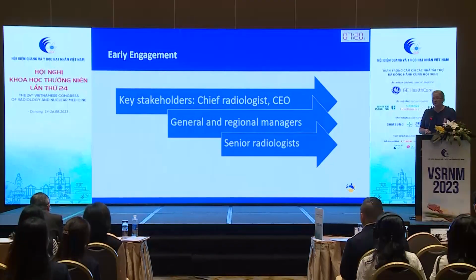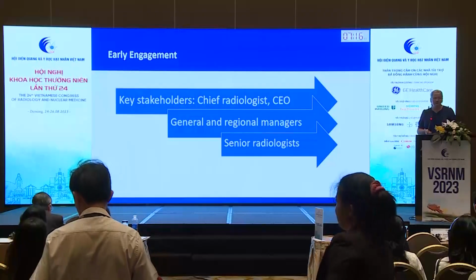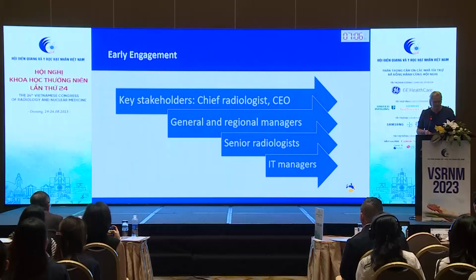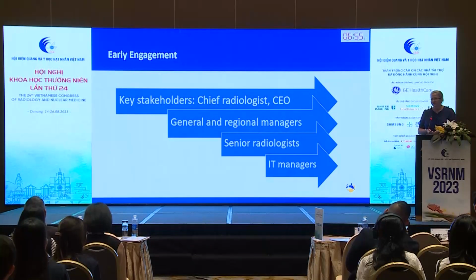Your senior trusted radiologists are absolutely key because they will make an opinion and the other radiologists will follow. So engage with them early. And never, ever, ever forget the IT managers, because they will be the success or the failure of any IT integration. So bring them in early.